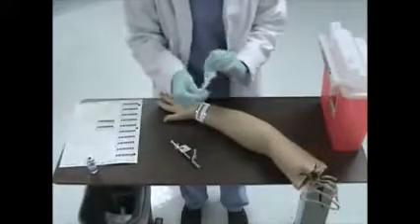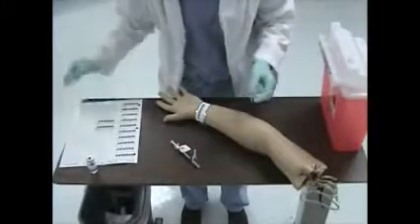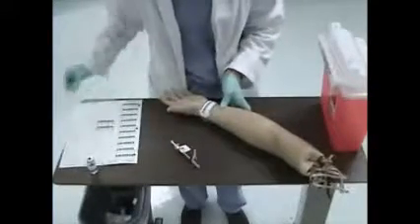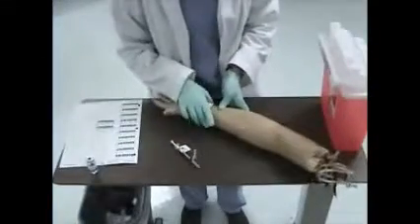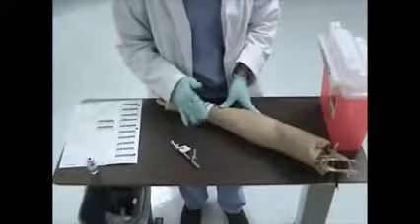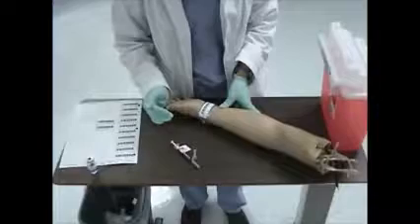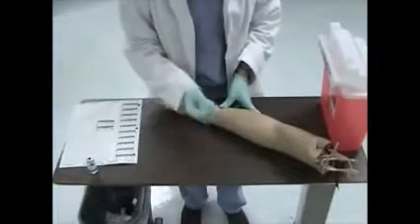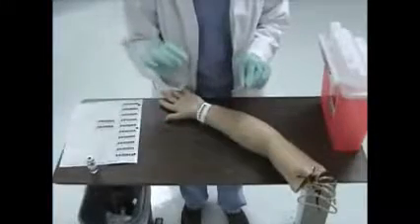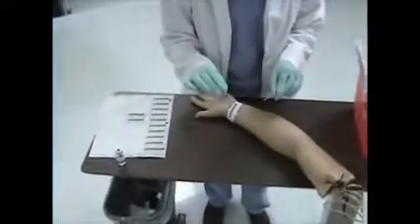I will cleanse the area with an alcohol prep. I will allow the area to dry. I will not be fanning or blowing on the area to dry the skin. At this point, I am going to uncap my syringe and throw my cap into the garbage.